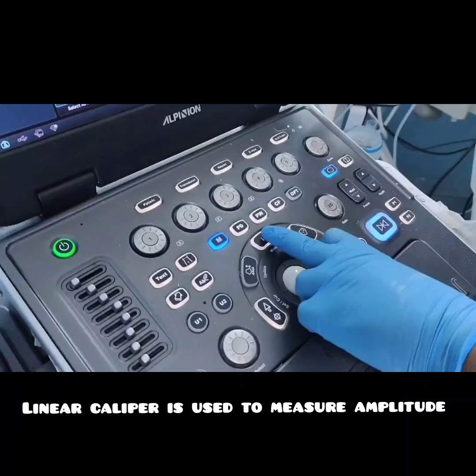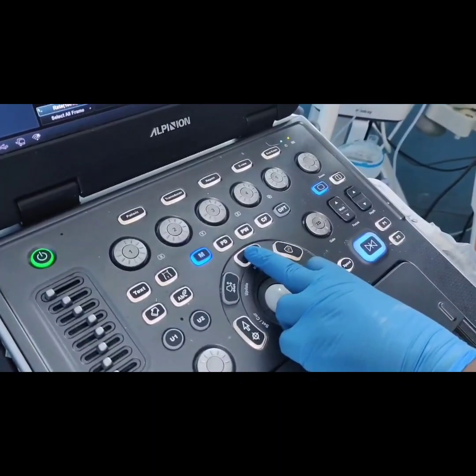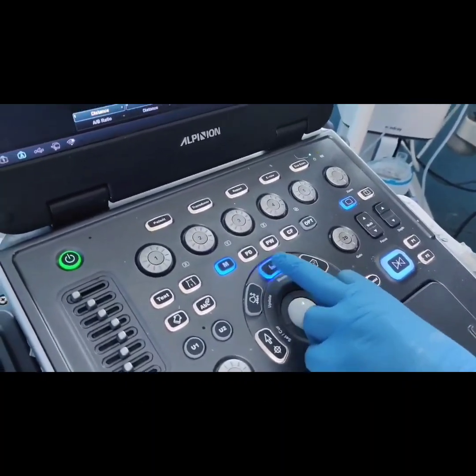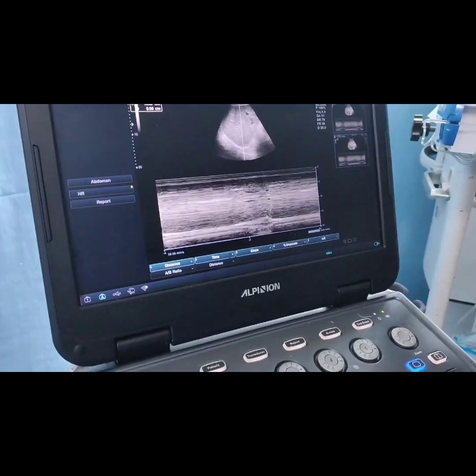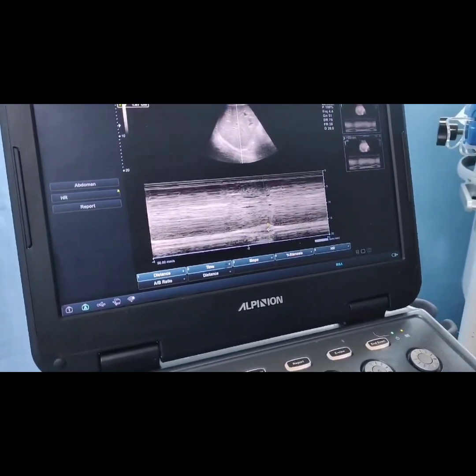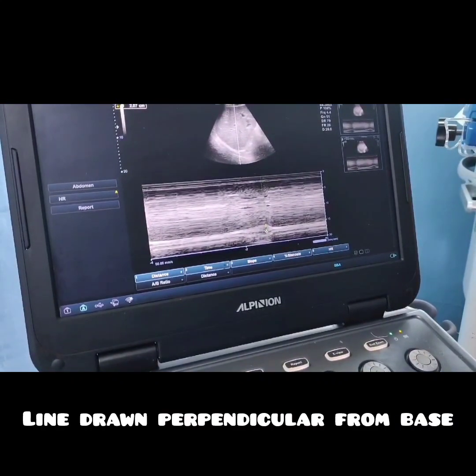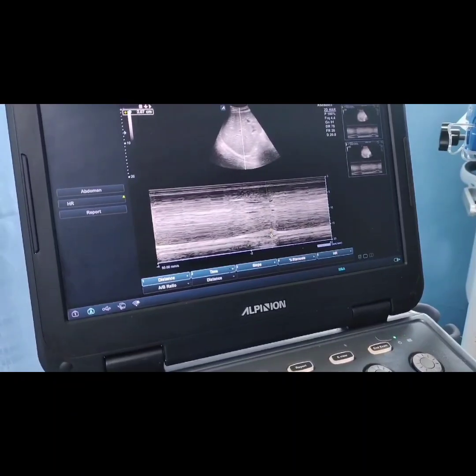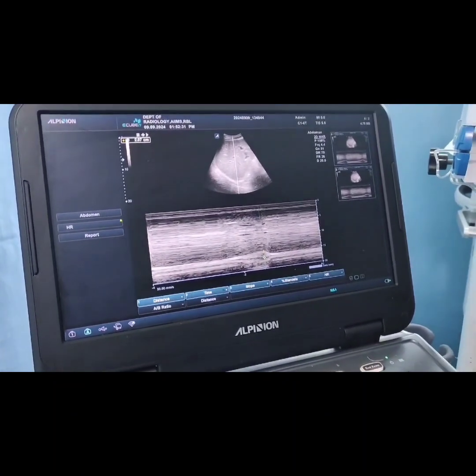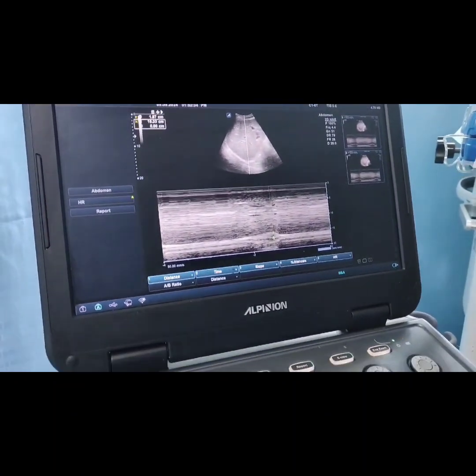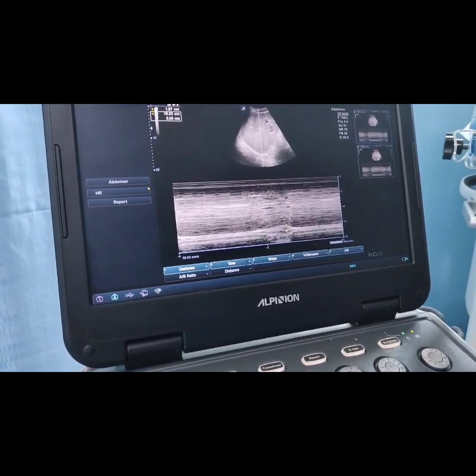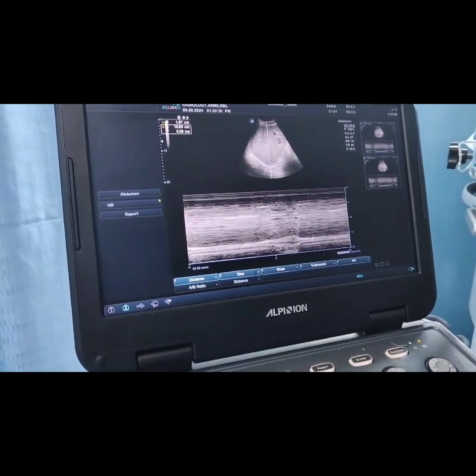We will now put the linear caliper and measure the amplitude. We are placing the linear caliper and measuring the amplitude of the peak. The line is drawn perpendicular to the base, and the measurement has come to approximately 18.7 mm.